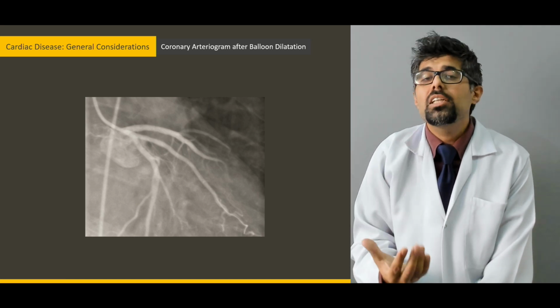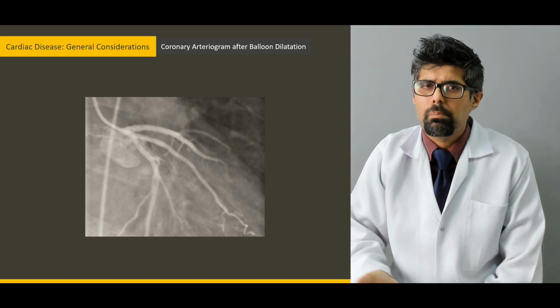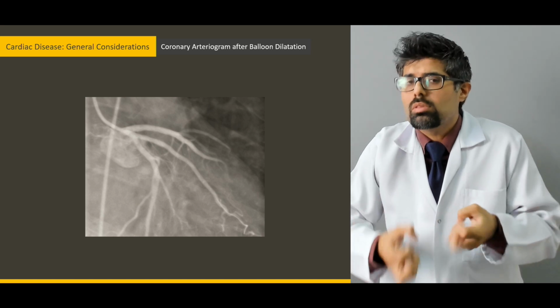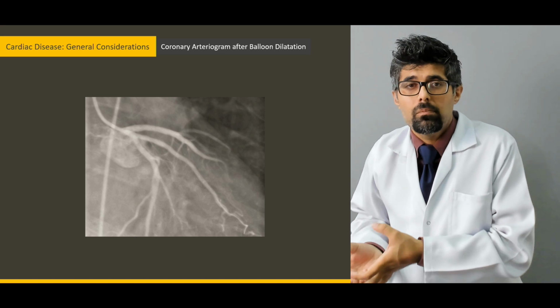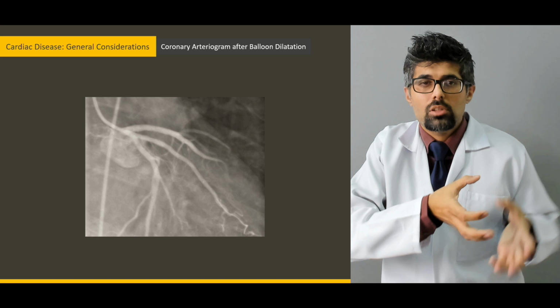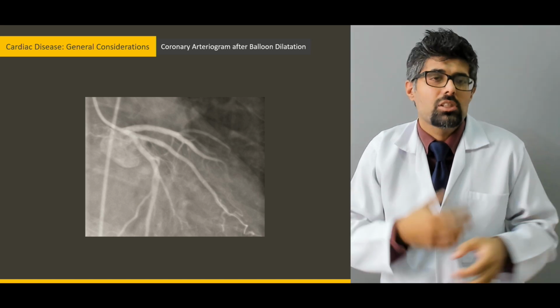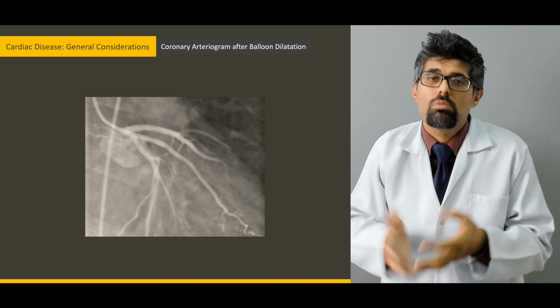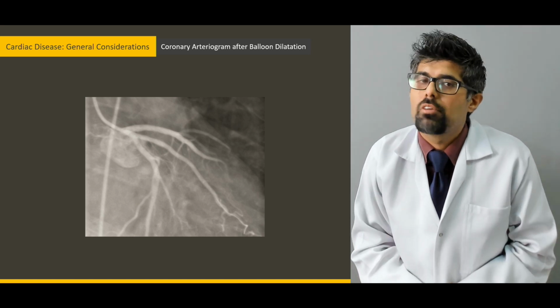So CCTA is slowly and rapidly gaining popularity, and it's going mainstream. Now, instead of having complex angiography or catheterizations and all those, we can simply perform CCTA and we know how to proceed from there. Such an example is given here.